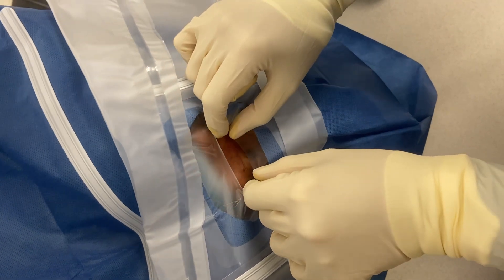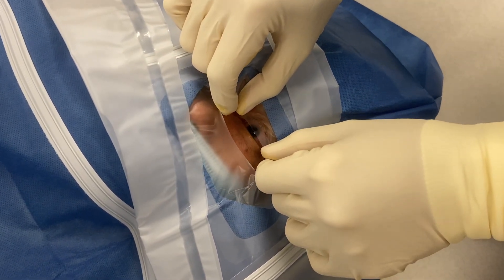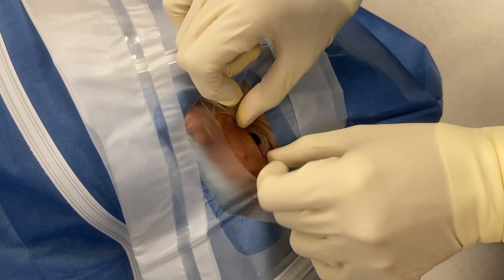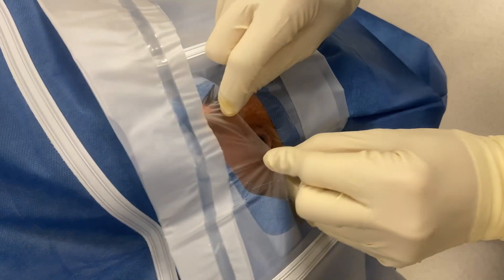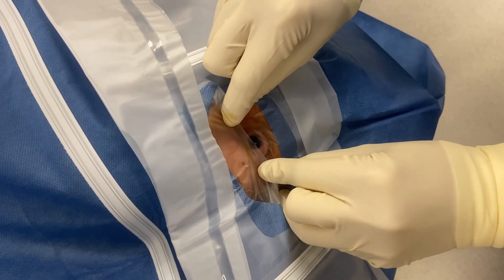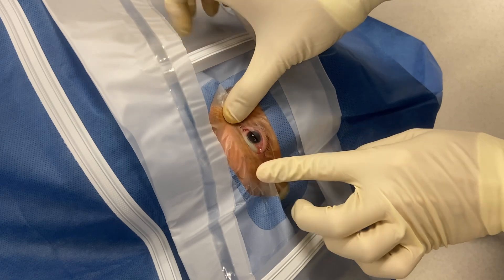Keep looking up here. You can grab the eyelashes. With the no-touch technique, you just put tension on the lower eyelid and overlap the edges.